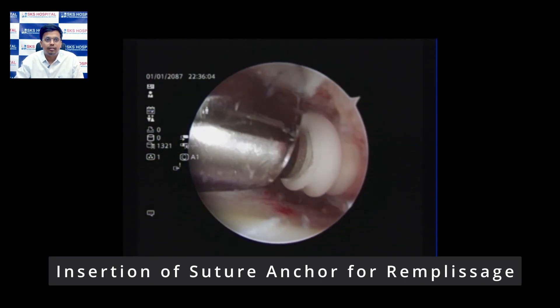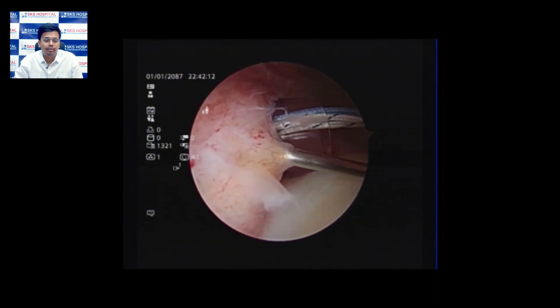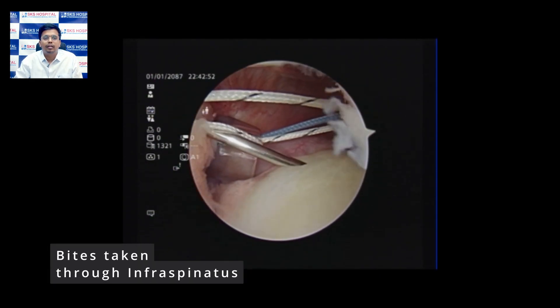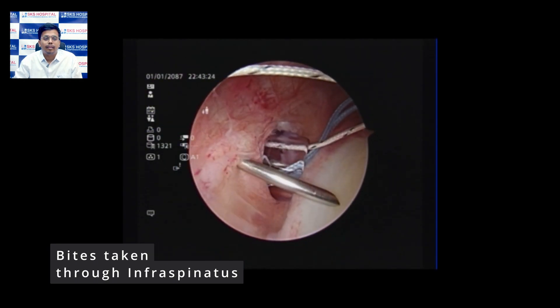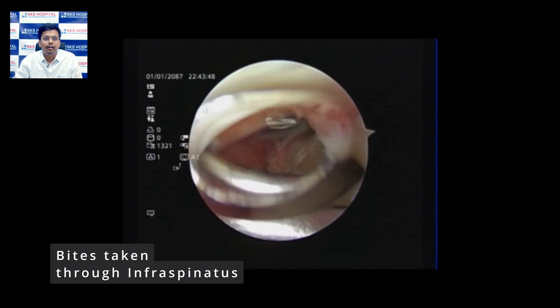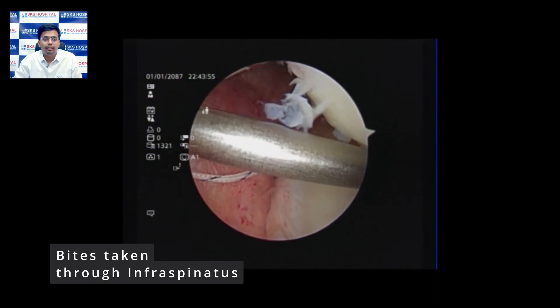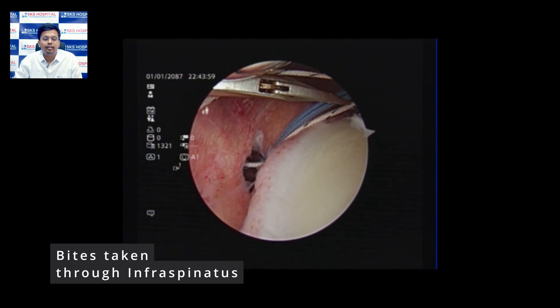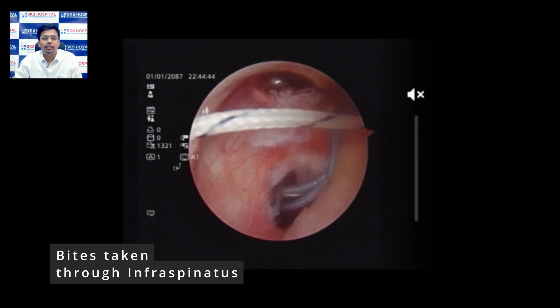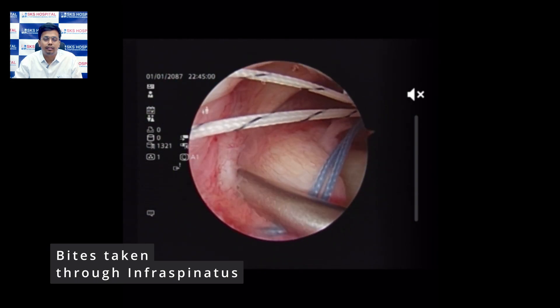We insert the suture anchor where the awl was placed, ensuring the anchor is seated deep inside the head and is not proud. We then use a spinal needle as a guide for the bird beak instrument. We take a bite through the infraspinatus and retrieve one of the suture threads. We repeat this step, taking another bite through the infraspinatus with the bird beak and retrieving the second suture thread — making sure to hold the suture thread so it does not get dislodged.